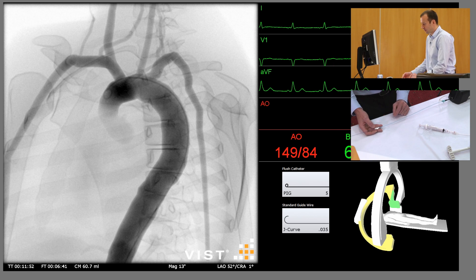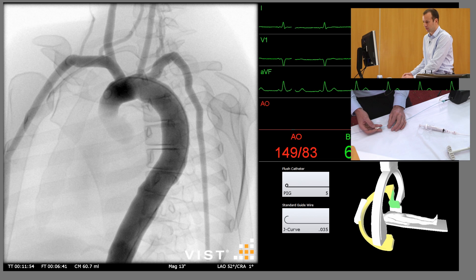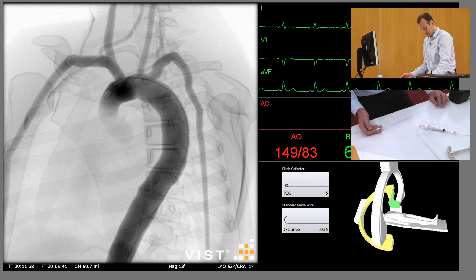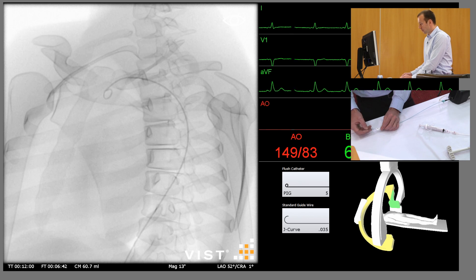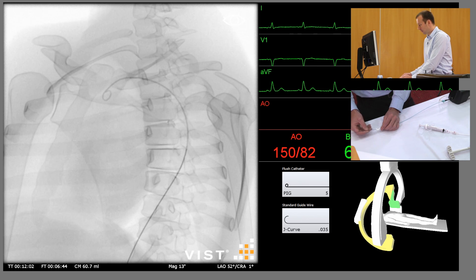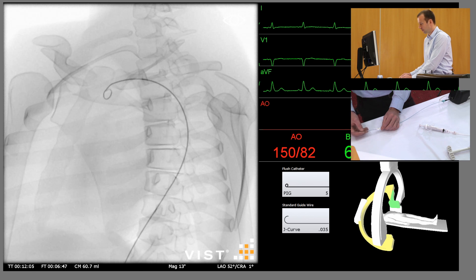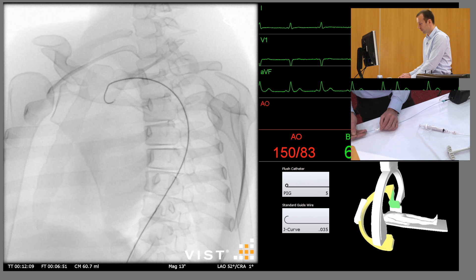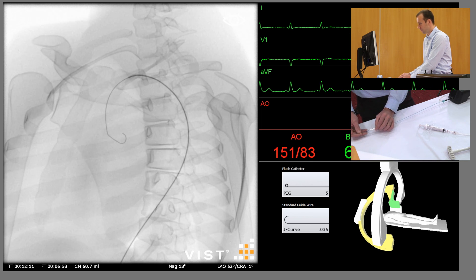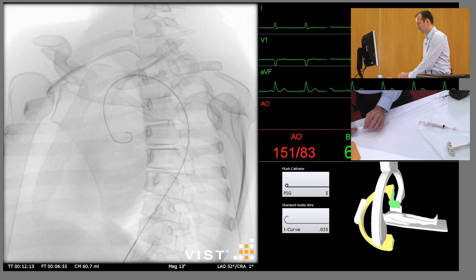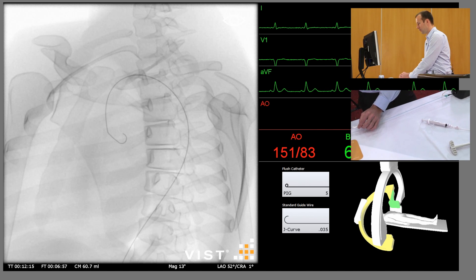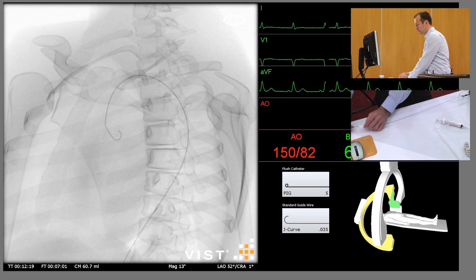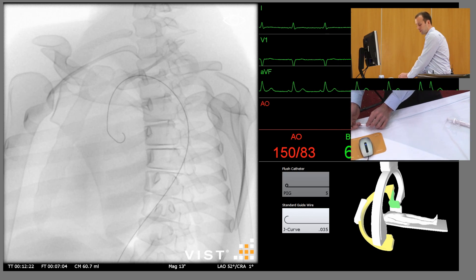We're going to selectively catheterise the origin of the innominate artery and do an injection directly into there. So we're going to reintroduce the J-wire and remove the pigtail catheter. Just be careful where the tip of the J-wire ends up — we want to try and avoid touching the aortic valve if possible.